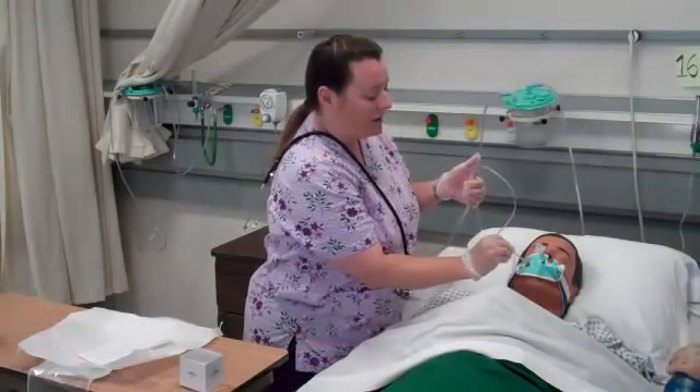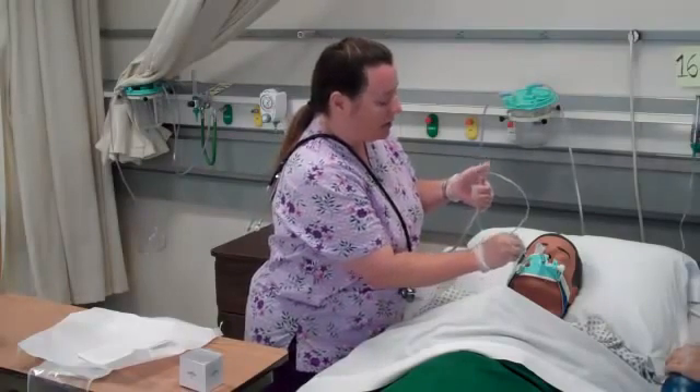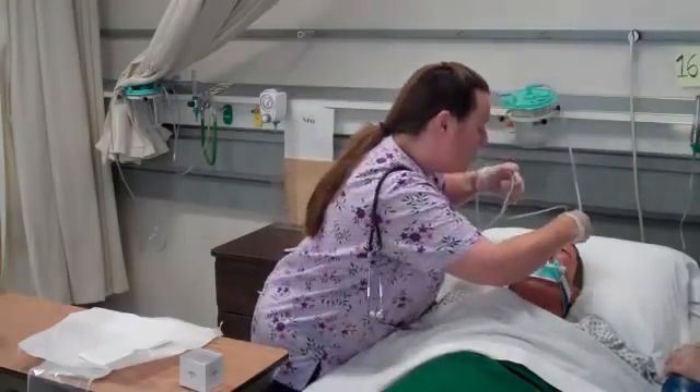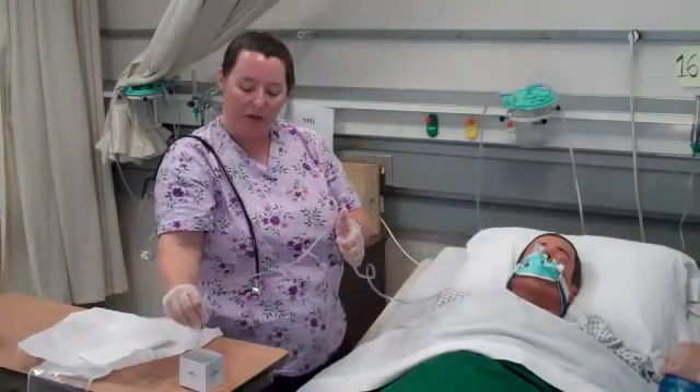This is now a clean procedure — the oral cavity is not a sterile cavity. I apply intermittent suction as I go around the oral mucosa. Then I clean my tubing before ending the procedure.